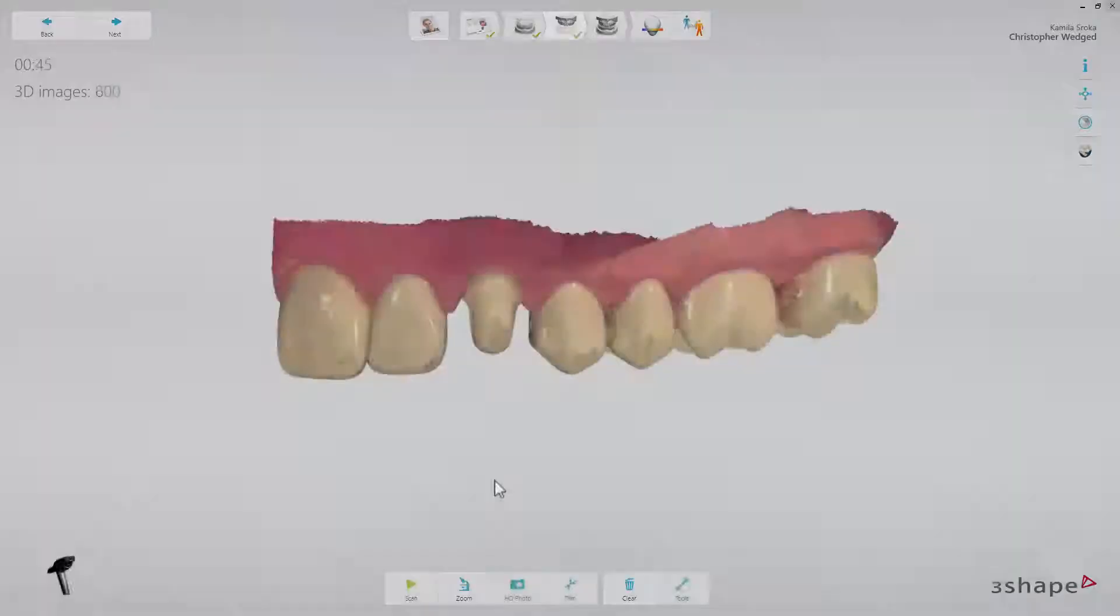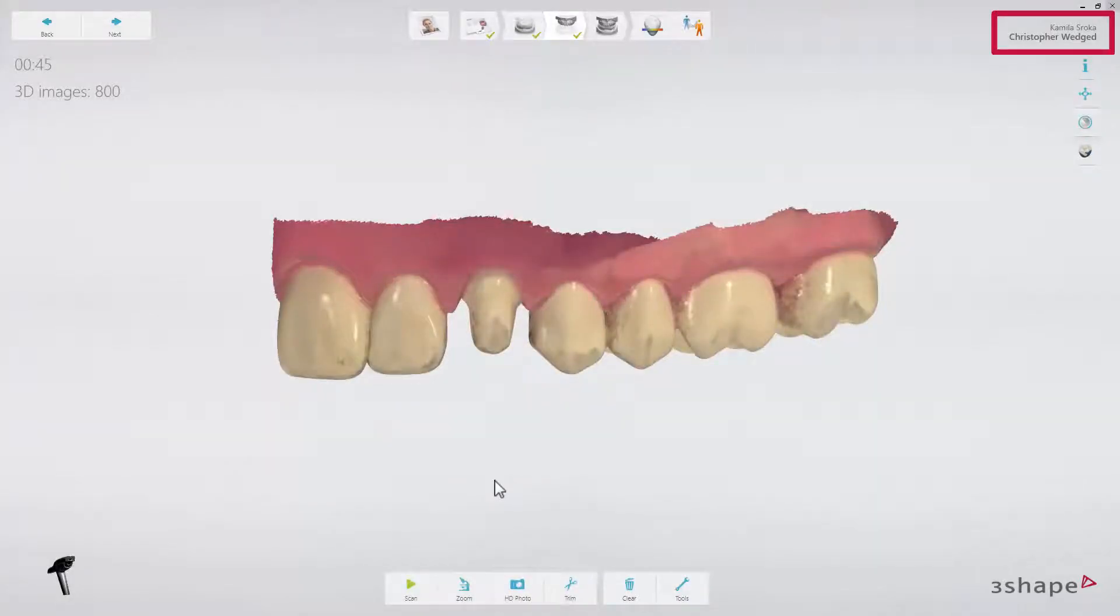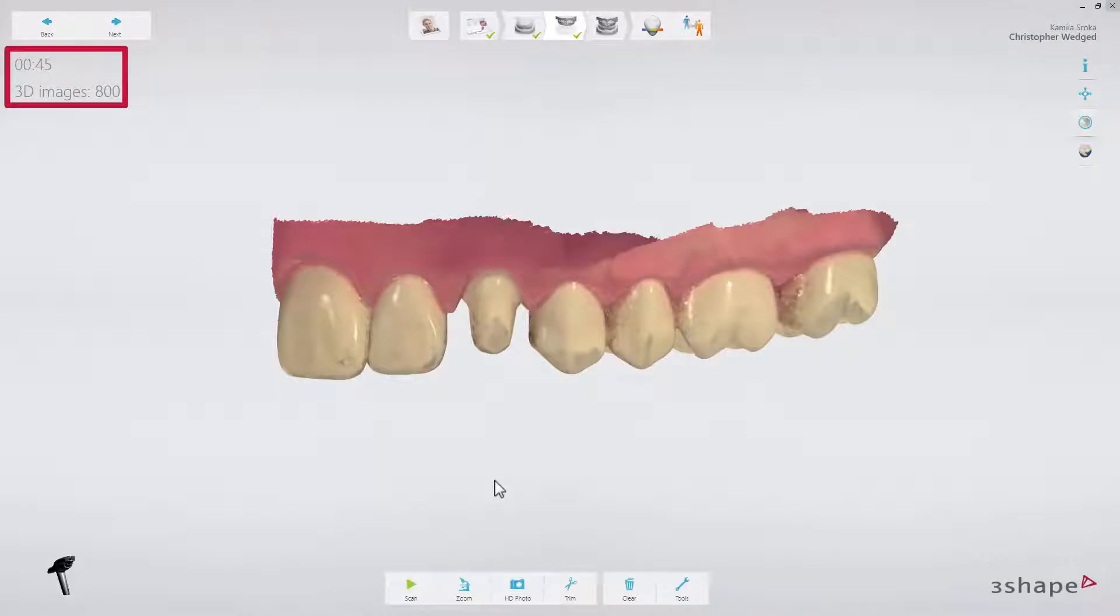On both sides, you can find additional information, such as the patient name on the right side, and the scan duration and amount of 3D images captured on the left side.